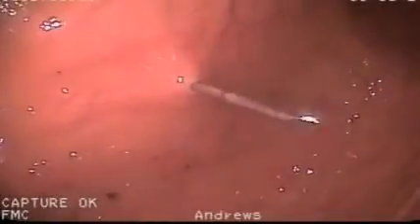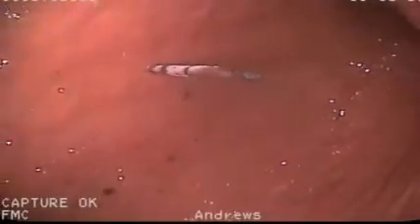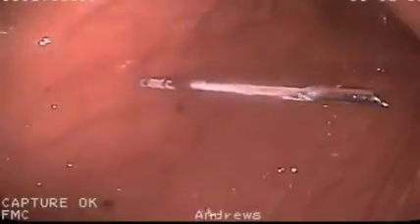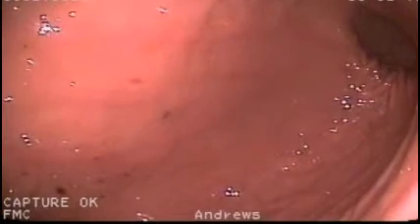This is the endoscopic view. First, the tracking anesthetic needle is inserted into the stomach. Then the needle biopsy assembly is inserted, and the biopsy notch is exposed. The entire assembly is then drawn back so that the biopsy notch straddles the gastric wall. Once placement is assured, the biopsy is fired, taking a full-thickness gastric biopsy. Note the minimal residual mucosal defect after the biopsy.